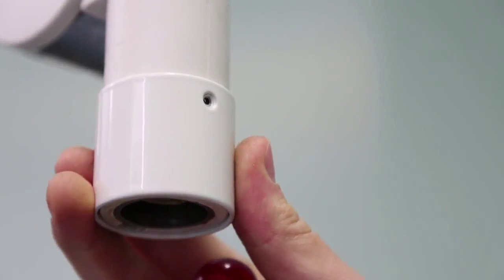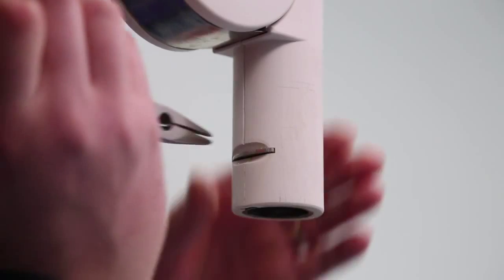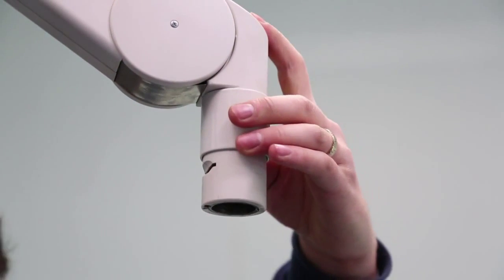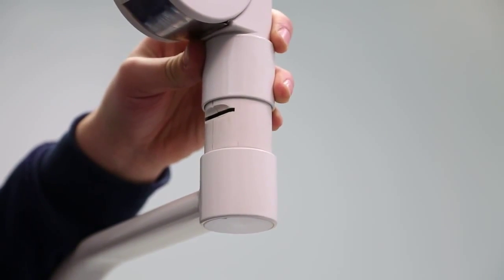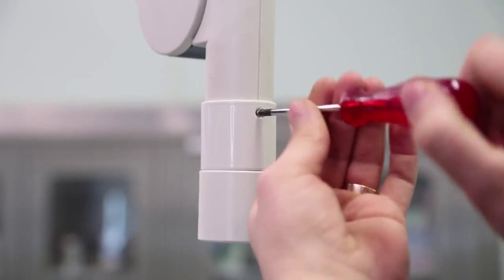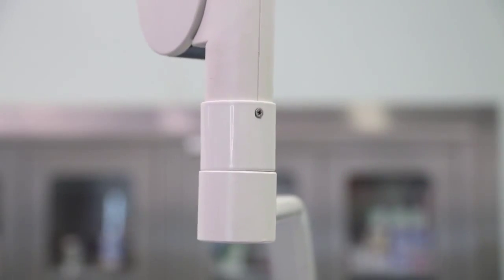Remove bracket screw from spring arm and take the bracket away from arm in order to perform lamp head assembly. Remove the wedge inside the slot, which is located under the bracket. Remove protection cover at the end of spring arm and then replace the bracket. Place lamp head on the slot above the spring arm and insert the wedge to its place. Lower the bracket, place its screw and fix it. Proceed with the same steps in the same order for other spring arm and head mounting operations.